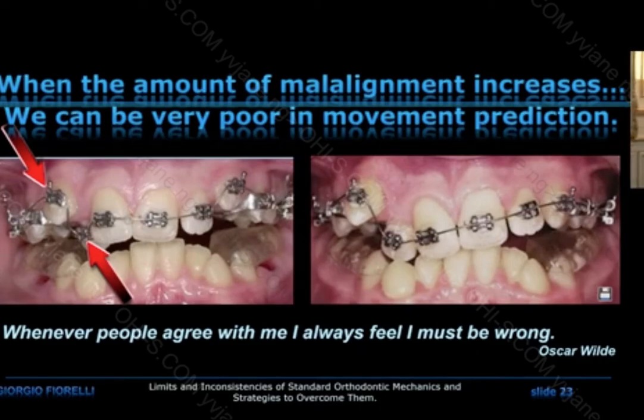The reason for this is something that is really hard to predict, but it's a phenomenon I want to explain, why this happened, though it's hard to predict it beforehand. So there is what we call binding here between these two teeth. You see here is just like a loop, okay?